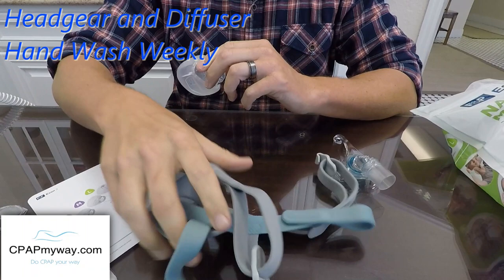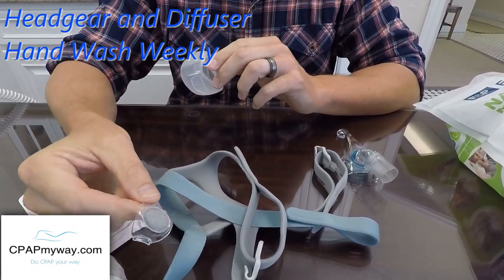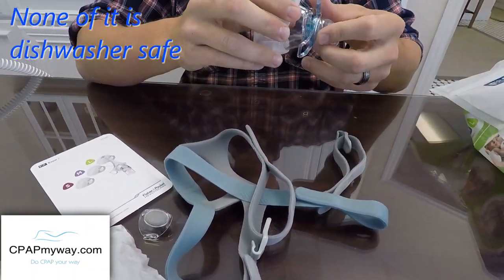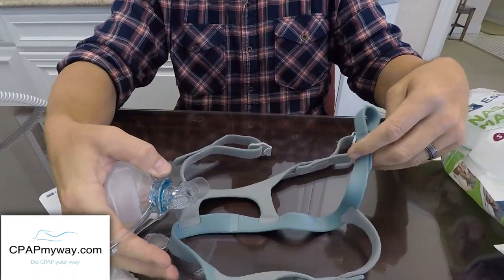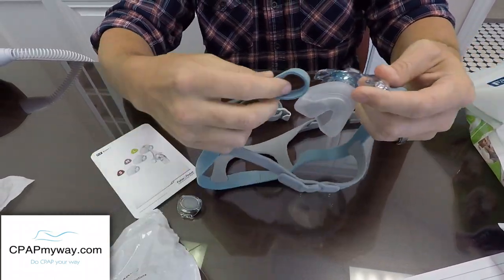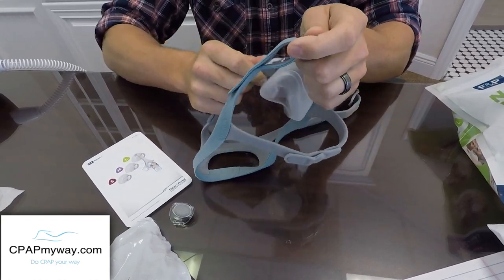The headgear and the diffuser here should be washed with mild soap and water, hand washed once a week. None of this needs to go into a dishwasher at all. When you're putting it back together, just make sure you lay the headgear out so that you can see what you're doing, and then slide it back into place, and everything should clip back the way it was.